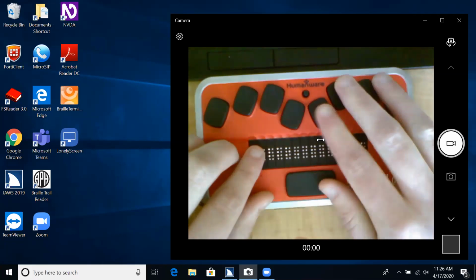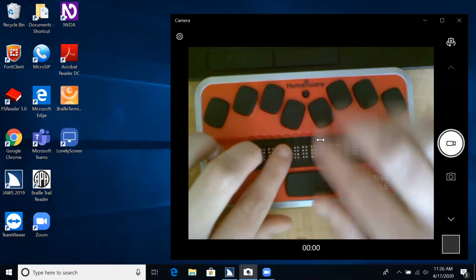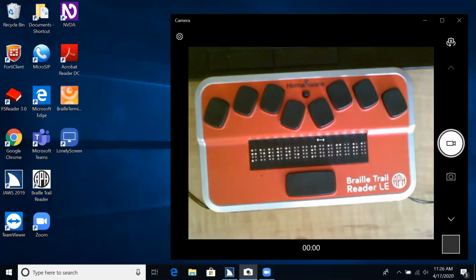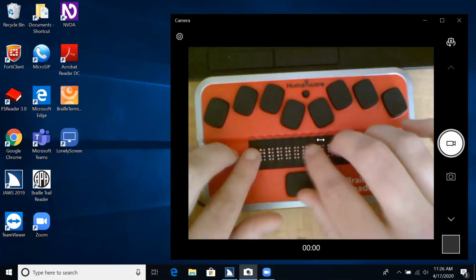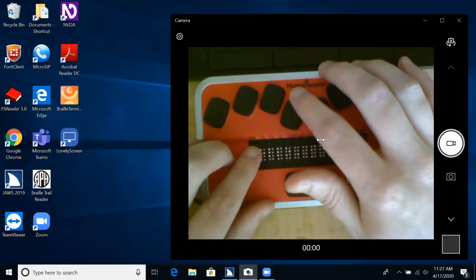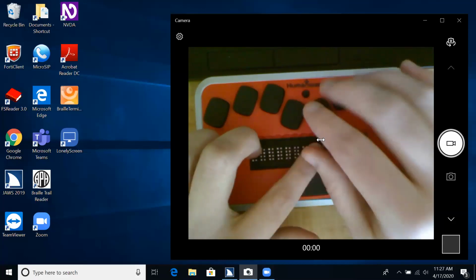At this point in time, you cannot rename notes, but they will be named with that first line of your document. You can move through your notes list by using the next or previous thumb key when you're in your list of notes. You can use first letter navigation as well. So being able to move through those notes can be important, especially if you're taking lots of notes and you want to refer to them.